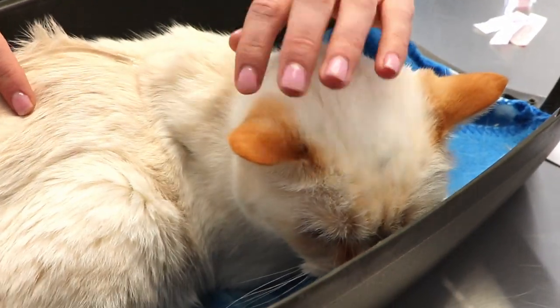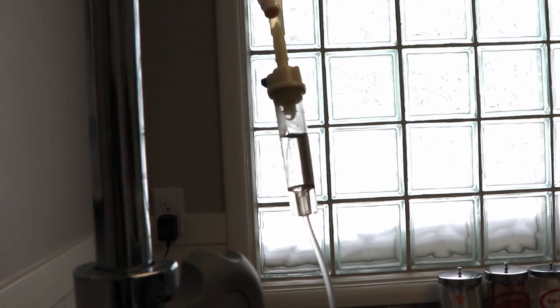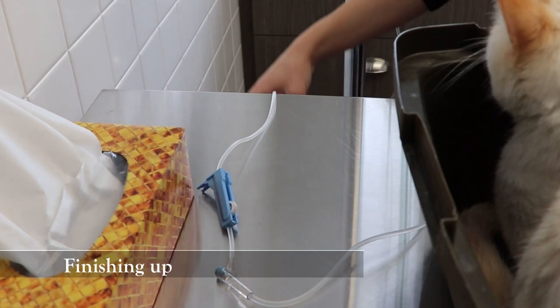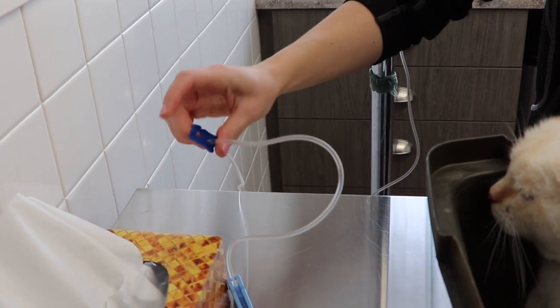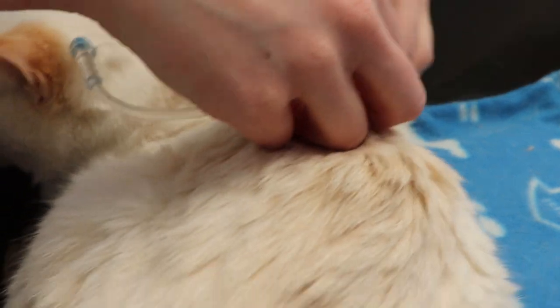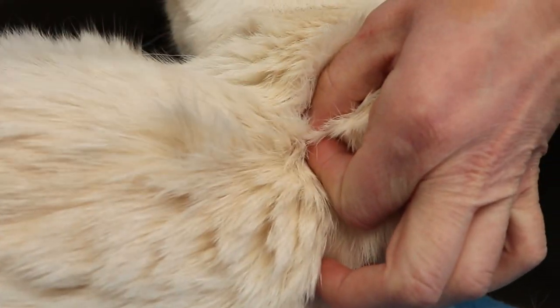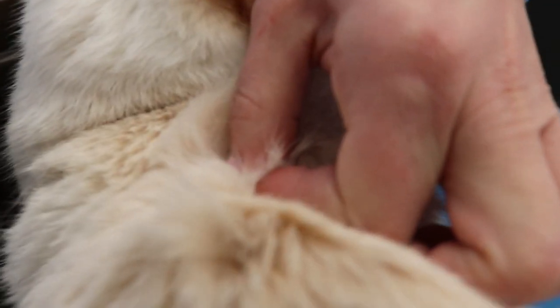And I was told it was for three days that we have to do this? Yeah, the three days prior to his surgery. And then these other clamps too — you can just push like that so that it doesn't drip any fluids after we take this out. Then you can just kind of pinch around the needle and pull it out, and then hold it for like a minute or so so that the fluids don't escape through the hole there.